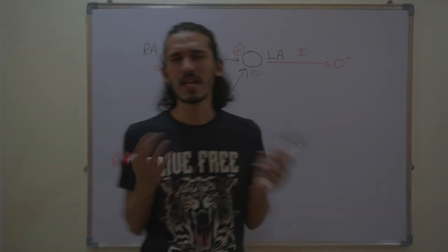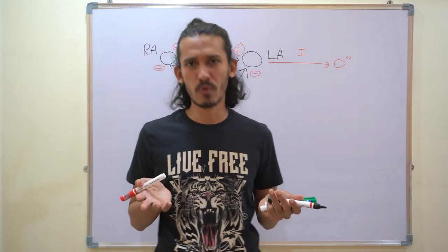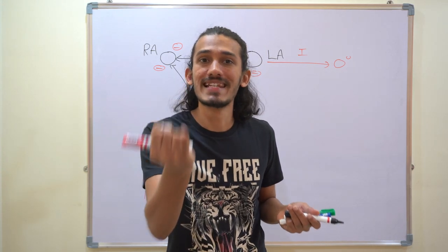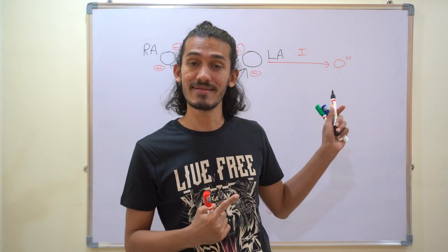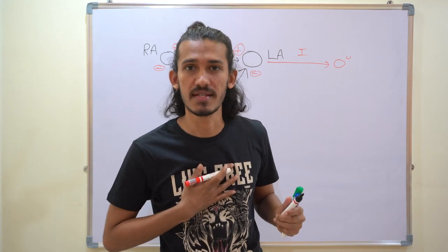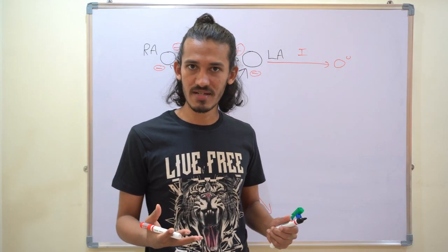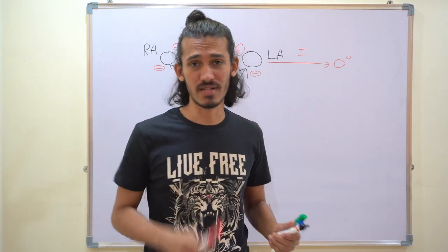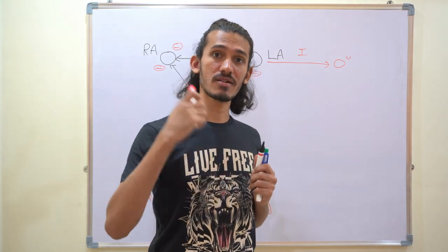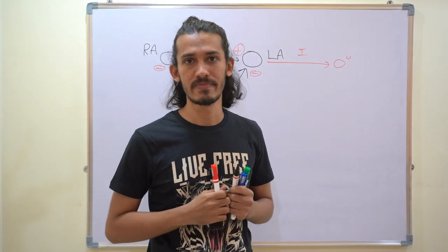Next are unipolar leads. When you talk about unipolar leads, they can be unipolar chest leads as well as unipolar limb leads. Earlier it was bipolar limb leads. Now we're talking about unipolar limb leads as well as unipolar chest leads, the precordial leads. How is that different? There is basically an inactive electrode, and we measure the active terminal potential with respect to the inactive terminal.